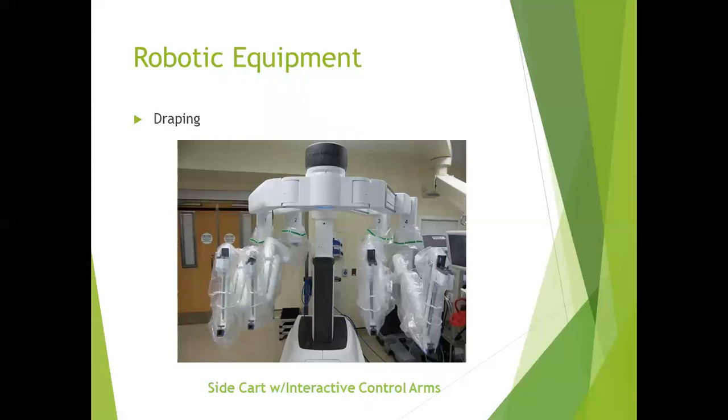This is called a side cart, or I think it's called a patient cart. So on your checkoff or your test, if you put side cart, that's fine. If you put patient cart, that's fine. Da Vinci calls it a side cart. Your book calls it a patient cart.